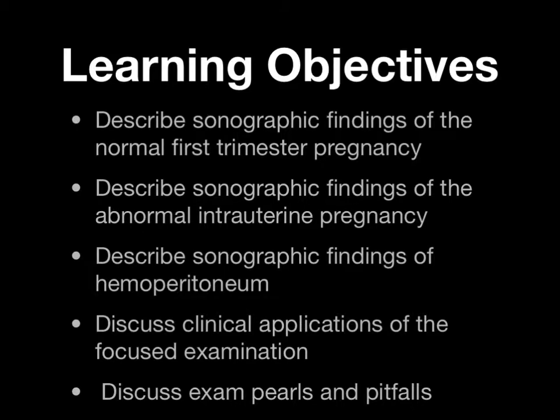At the completion of this lecture, the learner should be able to describe the sonographic findings of the normal first trimester pregnancy, describe the sonographic findings of the abnormal intrauterine pregnancy, describe sonographic findings of hemoperitoneum, discuss clinical applications of the focused exam, and discuss exam pearls and pitfalls.